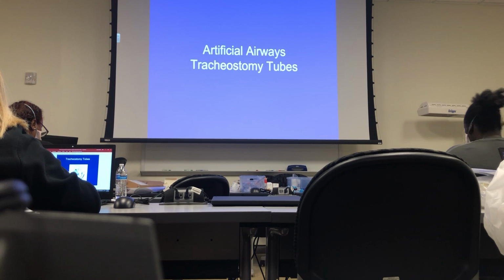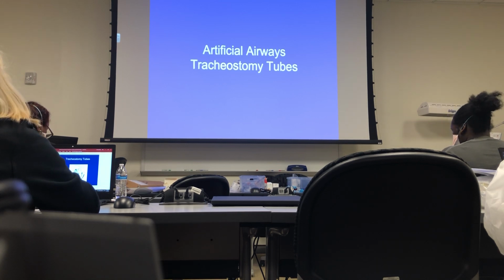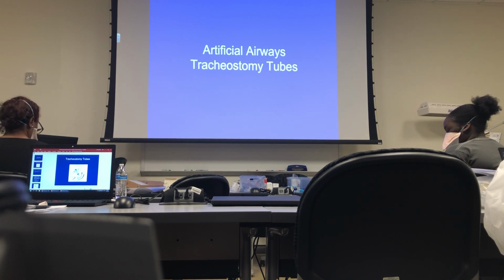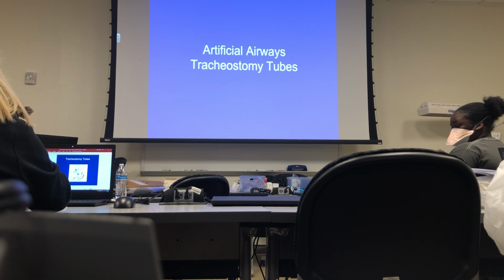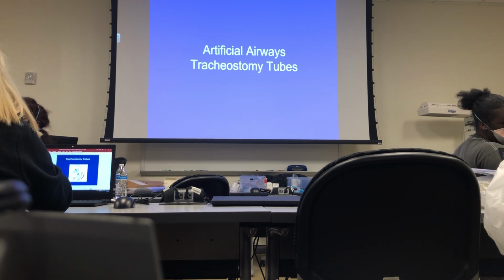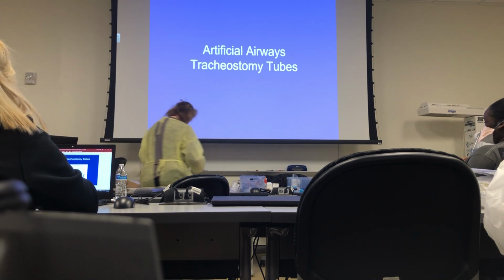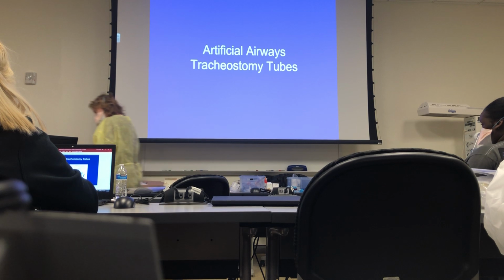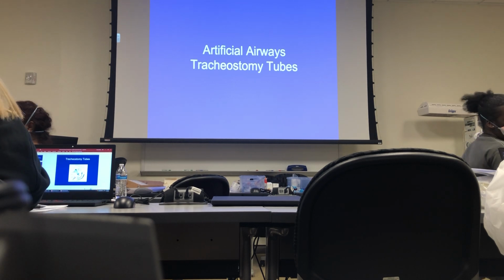Okay, so I want you to take out the inner cannula, put in the obturator. All right, did everybody put the obturator in? Feel the bottom. It's smooth, right? Will yours fit in? No. That's a smaller tube. Hold on. All right, Jovi, I'm gonna have you look at this, only this tube is different, okay? It's got holes in there, but that's not usual, all right? That's called a different kind of trach. So the obturator is in there, all right.